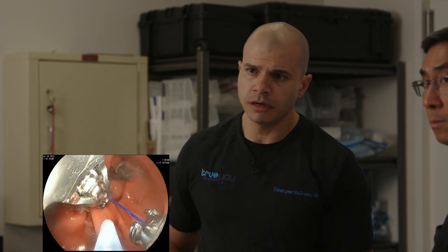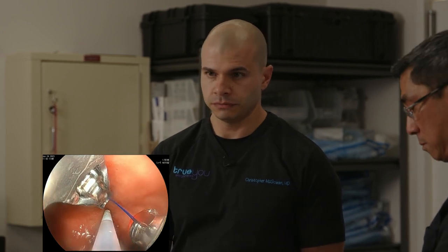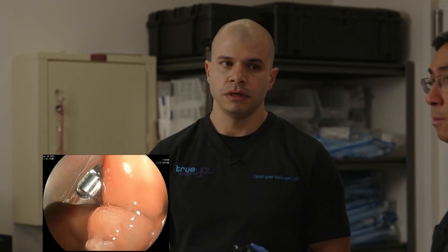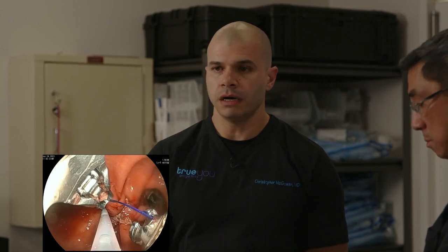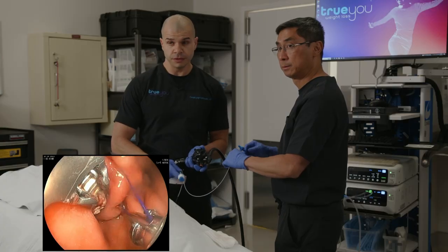All right, last suture here. We're just going to do a little straight line coming down to reinforce this a little more. And I'll take another question. Can you have more than one revision in your lifetime? And if so, is there a time limit between them? You can certainly have more than one revision. I mean, it really depends on the scenario. It depends on the nature of what the initial revision was. We have patients who have had prior surgical revisions, and maybe they weren't effective or weight recurrence happened again here. And so we can go in and tighten things again if needed. That is the beauty of the endoscopic approach, where we can really address almost any scenario safely.